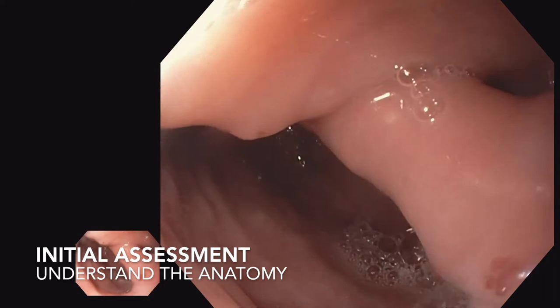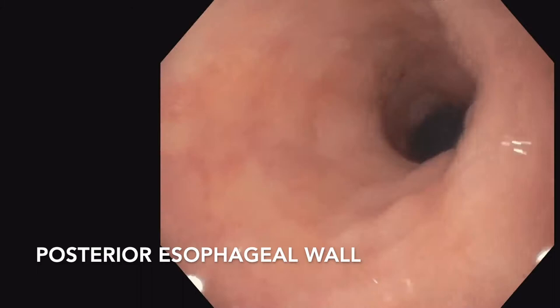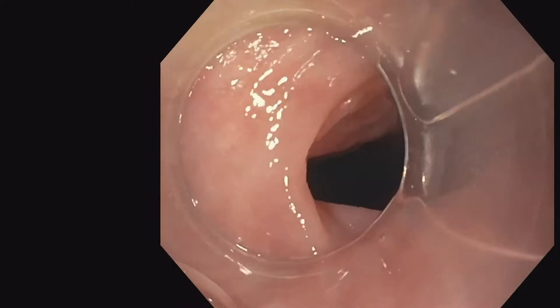Here's our initial assessment of the Zenker's diverticulum. You can see this deep Zenker's pocket in the posterior aspect behind the esophagus. Here we go through the Zenker's diverticulum. You can see there's a balloon from the PEG tube and the body of the stomach, and here we're evaluating further with a cap.